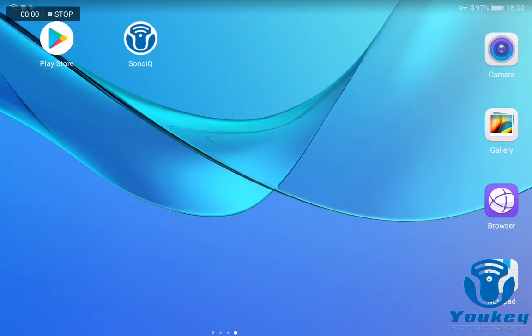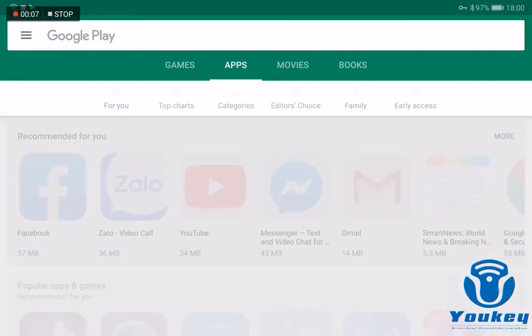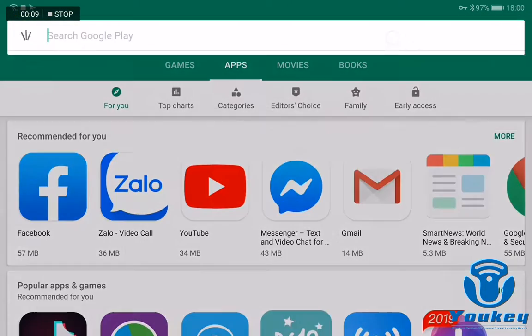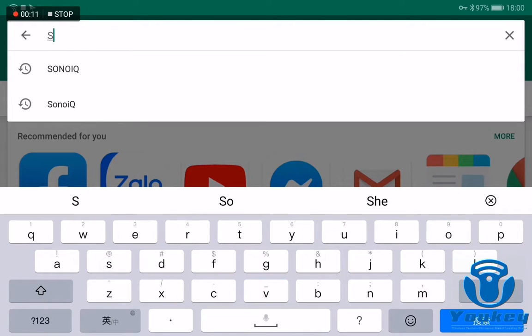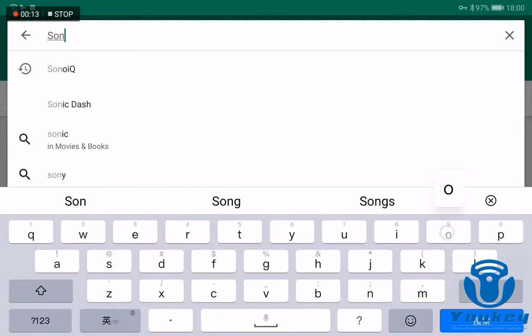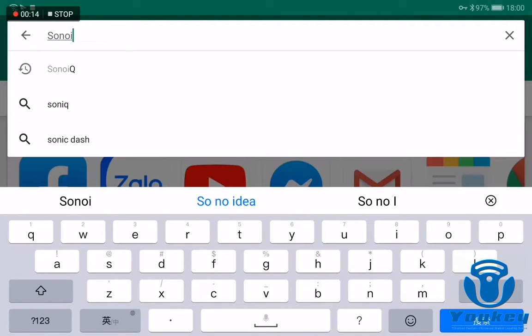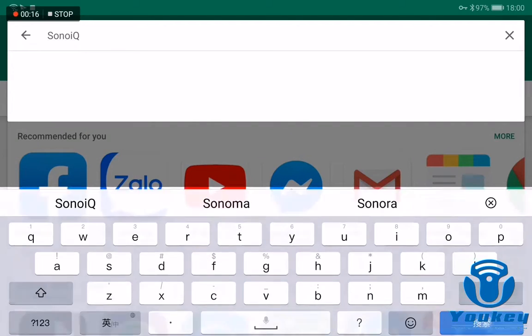I'll show you how to search and install the Youkey SonoiQ software on Android. First, enter the Google Play Store and input 'SonoiQ' or 'Youkey' to search for the software.